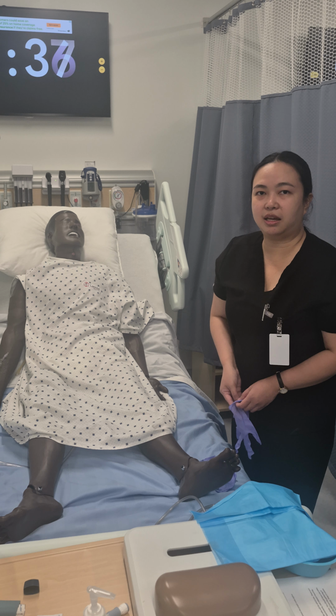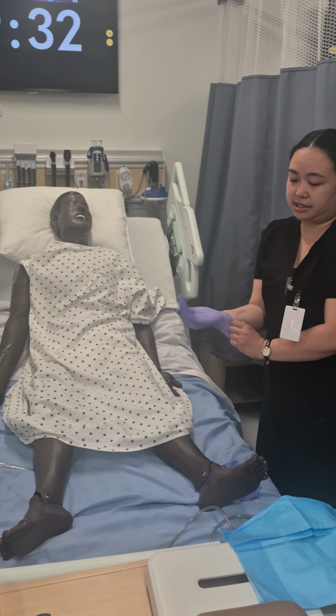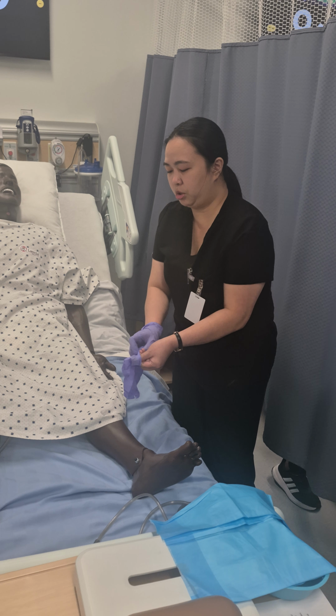Hi, good morning. My name is Laika, and I'm going to do the skills one, which is the oral suctioning. So Mr. Smith here has pneumonia, and she needs oral suctioning.